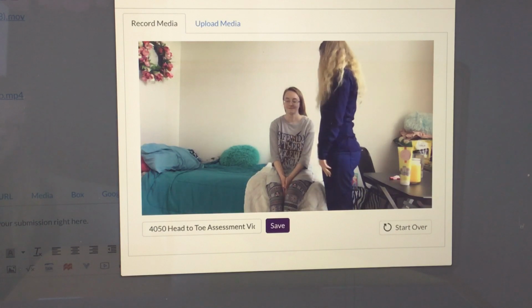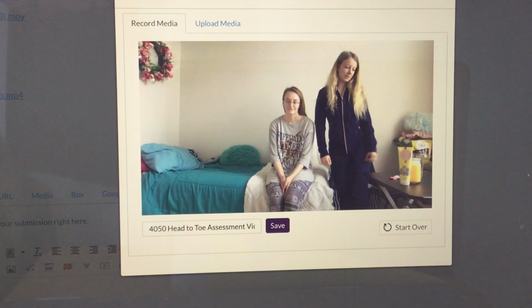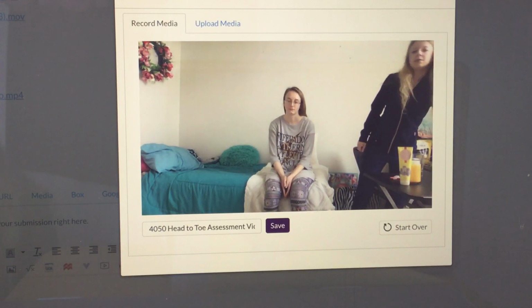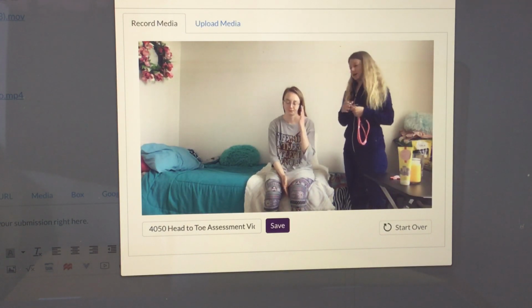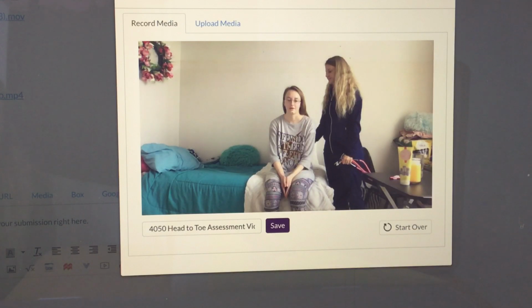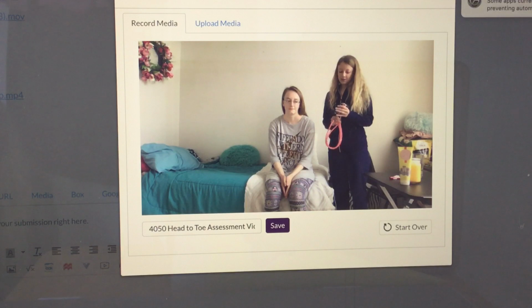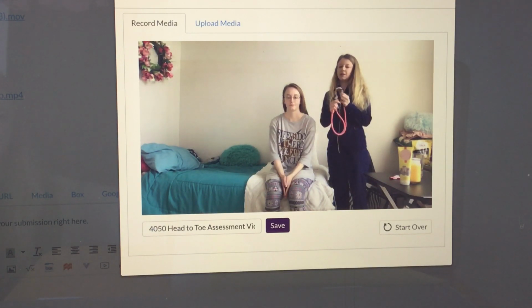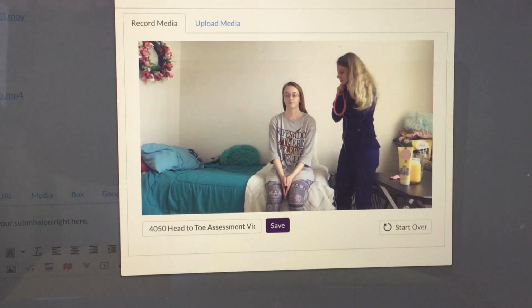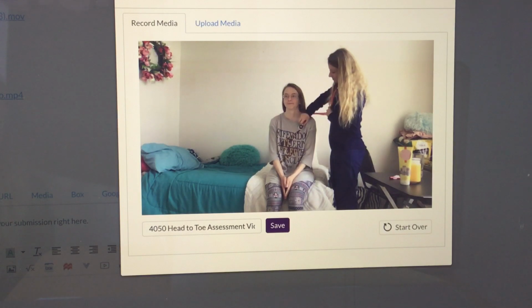Good. All right, so next we are going to move down to listening to the lungs. So first, I'm gonna check for fremitus. So can you say 99 for me? 99, keep saying it. 99, 99, 99. Okay, good. So now I'm going to listen to all of the fields. For time's sake, I'm gonna go pretty quick. So take some deep breaths for me too while I'm doing this.